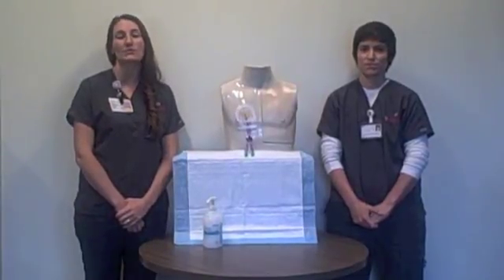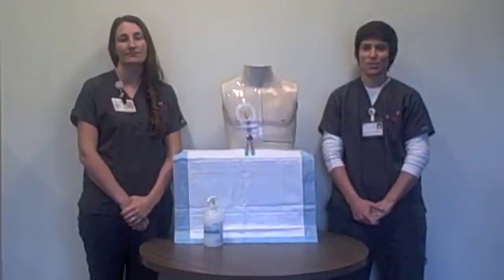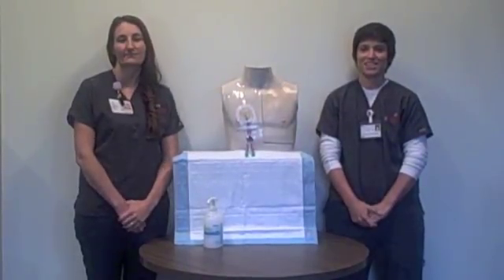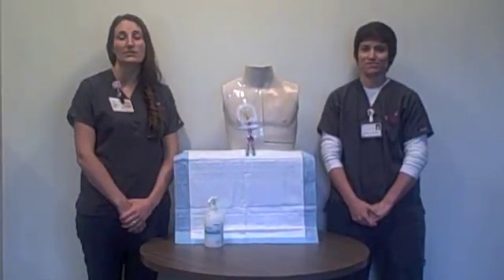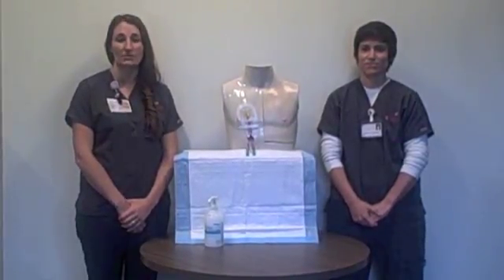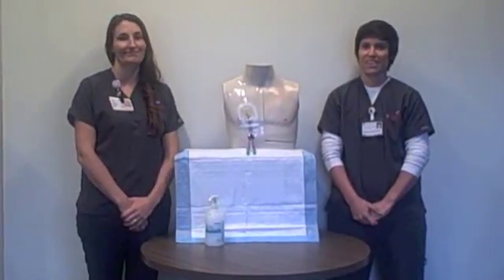In this video, we will review some important concepts such as the importance of good hand washing, how to change your dressing, how to flush the catheter to prevent clotting, and how to change the valves. We will also discuss what to do in case of line emergencies and review the signs that may indicate an infection. Let's get started!